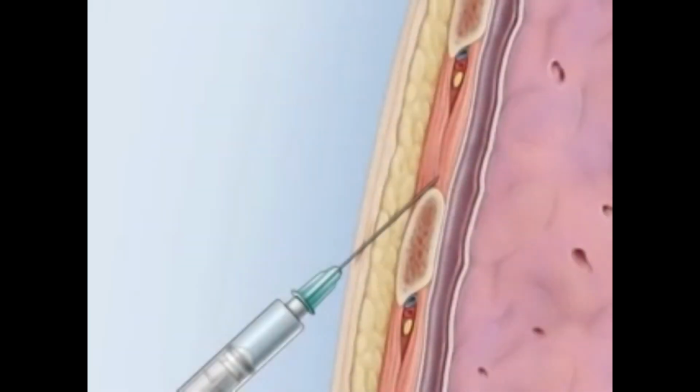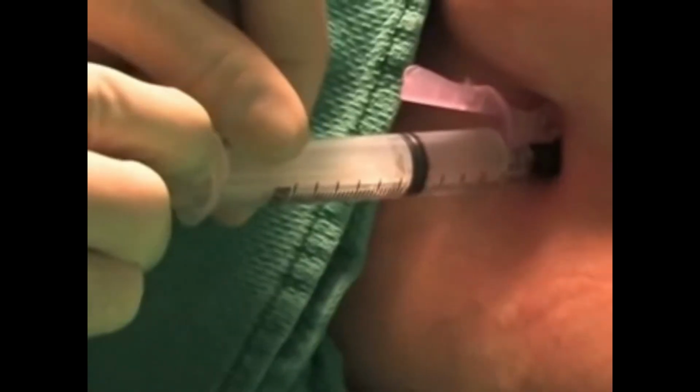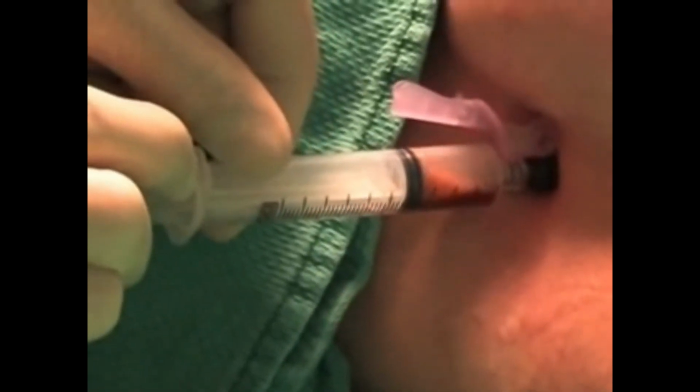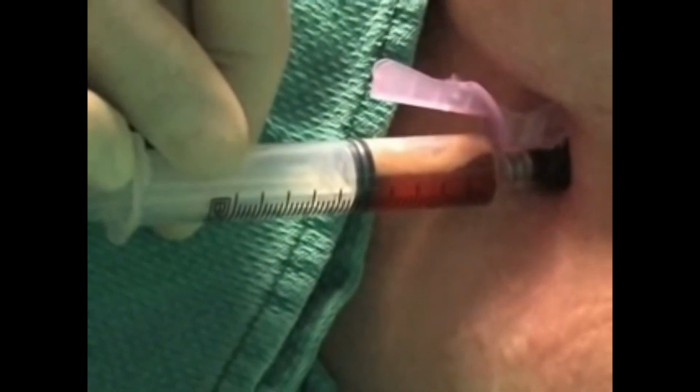Start anesthetizing the area, including the skin, the subcutaneous tissue, and the parietal pleura, and anesthetize the periosteal surface of the rib that lies below the intercostal space where the tube will be inserted. Once the parietal pleura is encountered, a flash of pleural fluid will fill the syringe if fluid is being evacuated. If pneumothorax is being drained, only air may fill the syringe as the needle enters the pleural space.